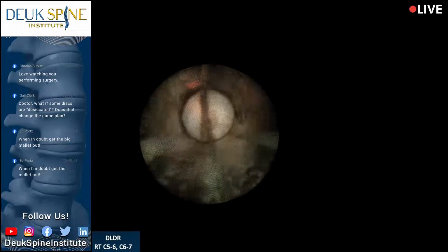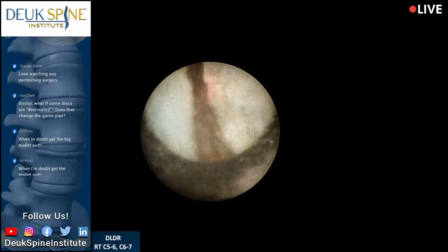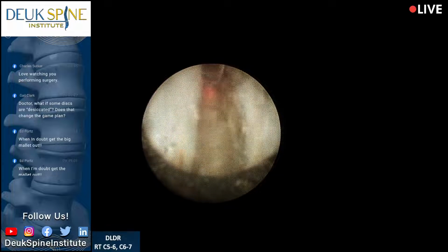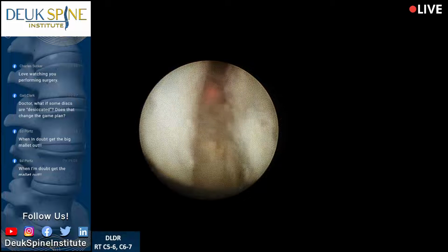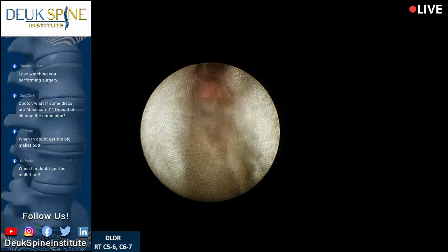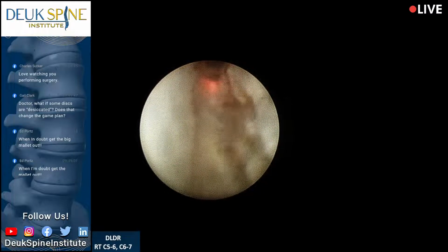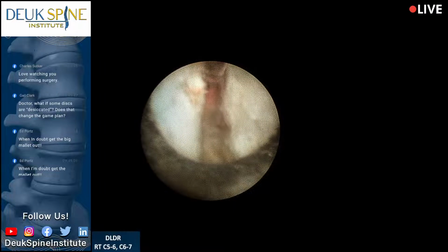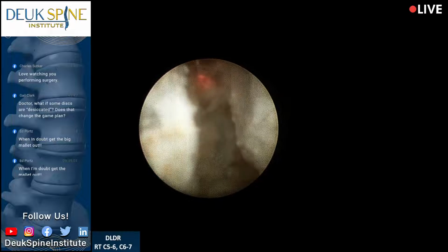So far, so good. Remember, we are still on the first disc that we're fixing. We have found that most patients need 2 discs. As a matter of fact, my paper that we published shows 2.4 discs on average per patient. That means if we were to fix the discs that are causing patient symptoms properly and get a 98% elimination of pain, then you need to treat more than 1 disc on average.